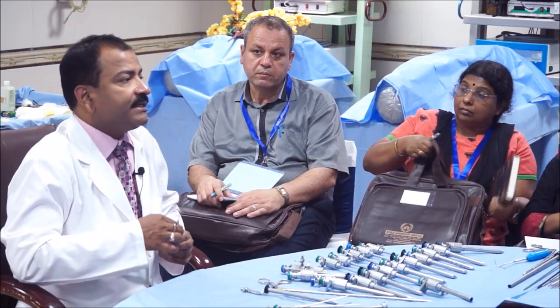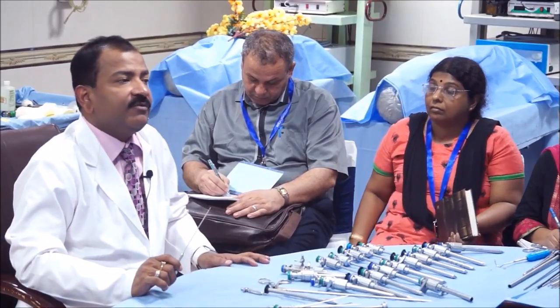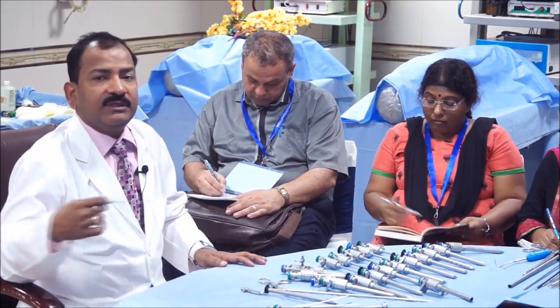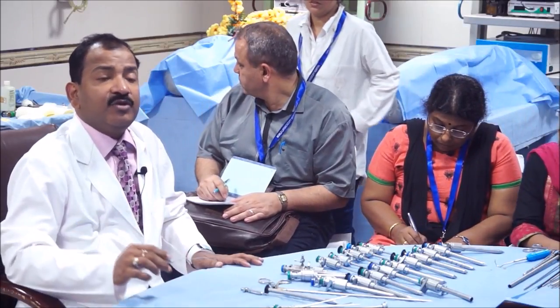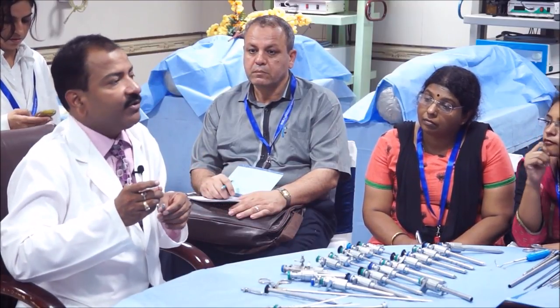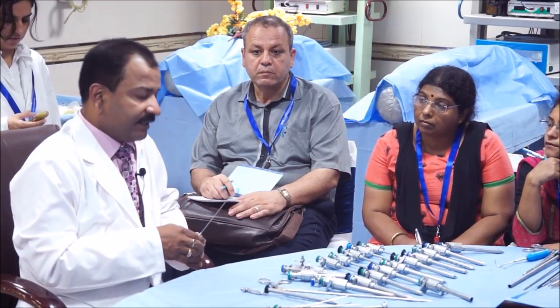Going to discuss is Veress needle. Veress needle was invented by one physician, his name was Veress. His idea was that there should be some instrument which can be introduced into the chest for pleural aspiration, so that there will be a blunt tip, so that after going into the space where the fluid is accumulated, the blunt tip will come in front and it will not damage the lung. That's how he invented it.